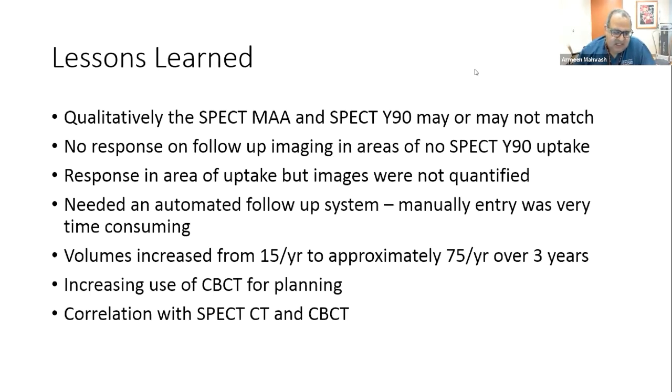So we did look at response in areas of uptake that you could see on the qualitative imaging. If we had no uptake at all in the area of the tumor on the post-administration SPECT, we realized these patients didn't respond. So there could be technical issues, or maybe the tumors were just so hypovascular you didn't get any activity in there. But that was also a learning experience for us.